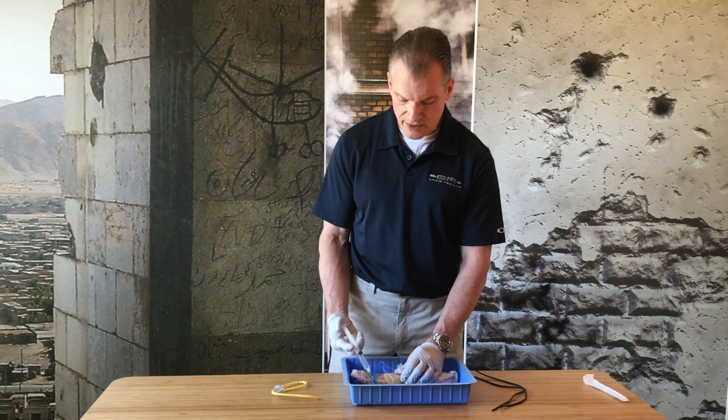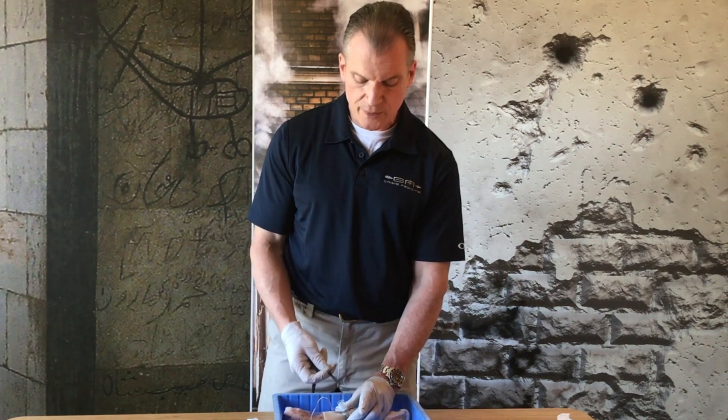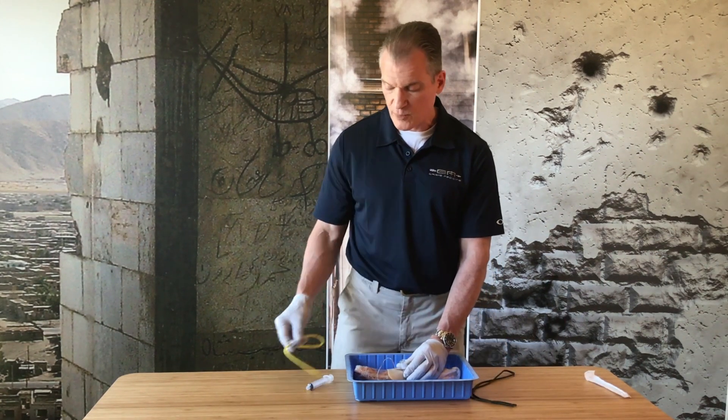We can then inflate our balloon. The only other thing we would have to do is tie it in place. That would be a surgical airway using the NAR tracheostomy tube with a preloaded bougie. Pretty cool way to go.